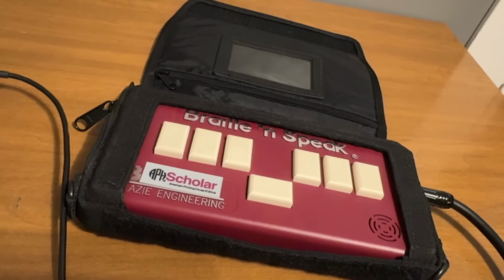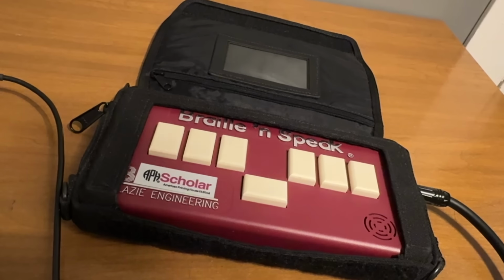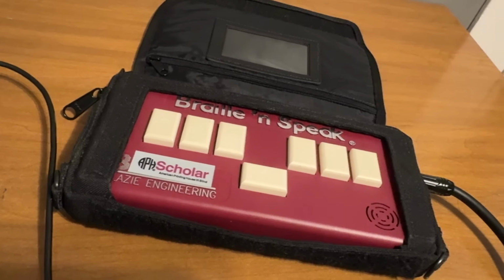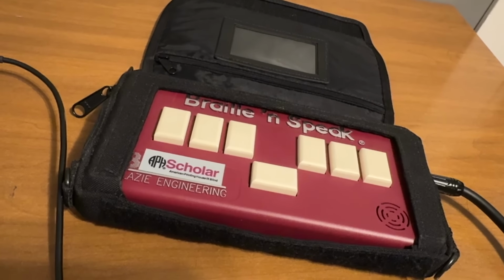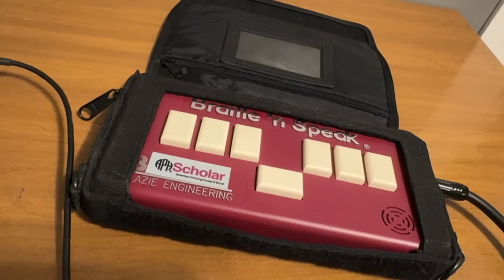Reset code: hold down Cord-I at power on. This will reset your unit to its default parameters. You will be asked if you want to initialize the file system. If you answer Y, all file titles will be erased from the file menu. Finally, you will be asked if you want to delete all data in the file area. If you answer Y, all your files will be permanently destroyed.